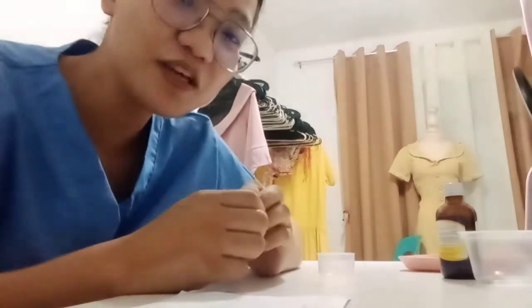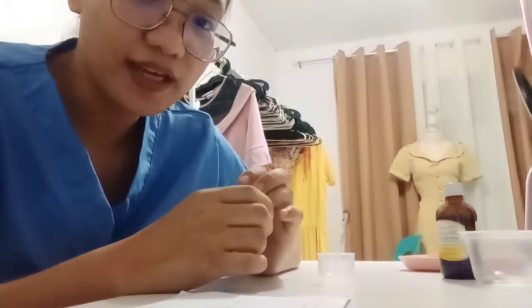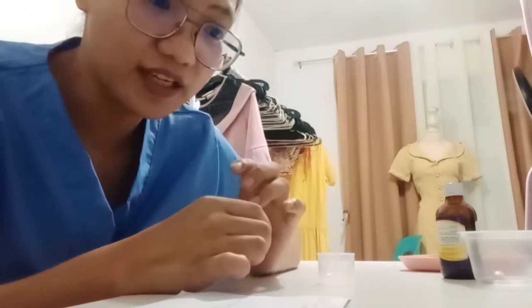So, when giving a small amount of medication, for example, less than 5 ml, prepare the medication in a sterile syringe without a needle. So, we will get 2 ml of the medication.